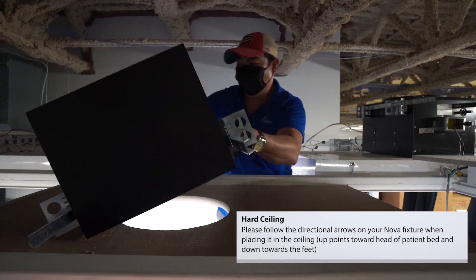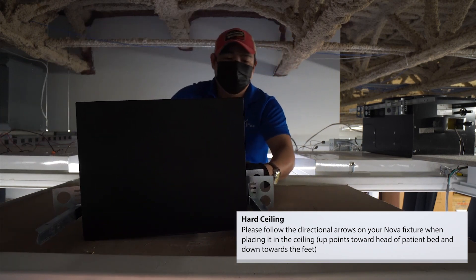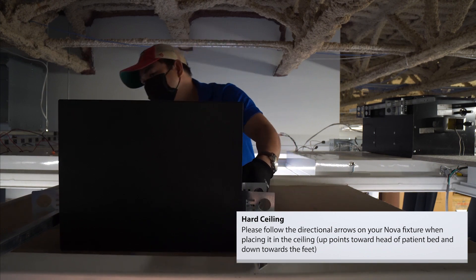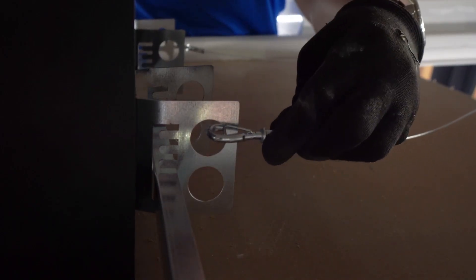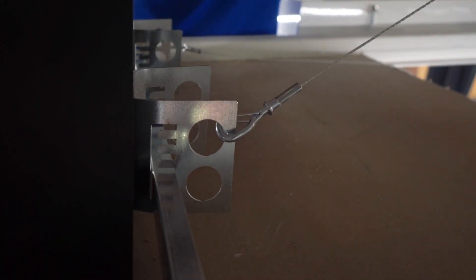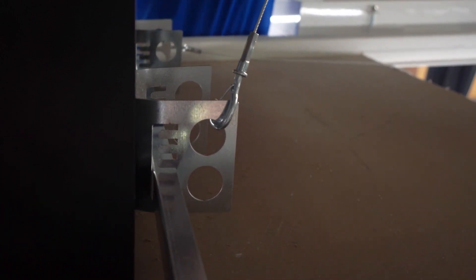Place your NOVA fixture on the ceiling tile and align properly in the tile cutout. Attach one aircraft support cable to each of the four mounting brackets on the NOVA box and connect them to ceiling supports.